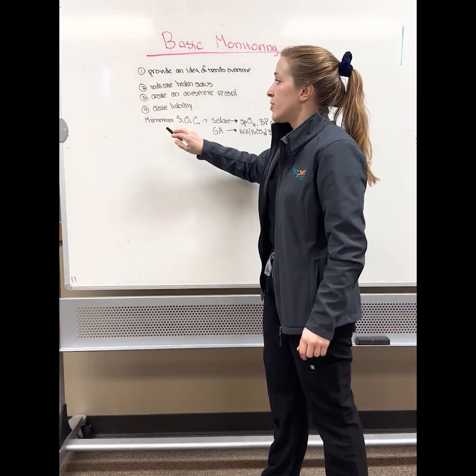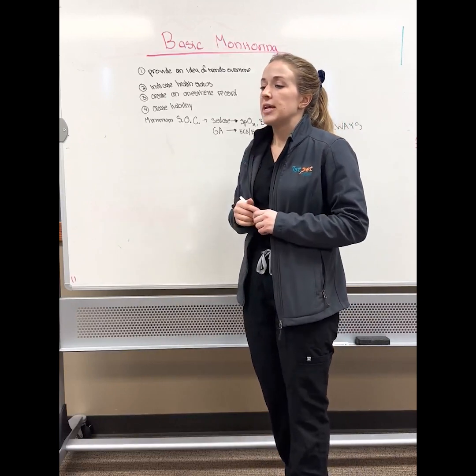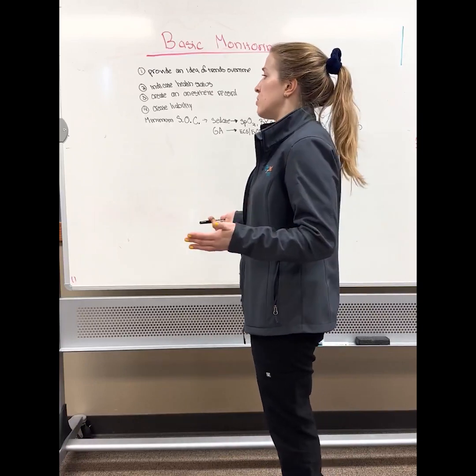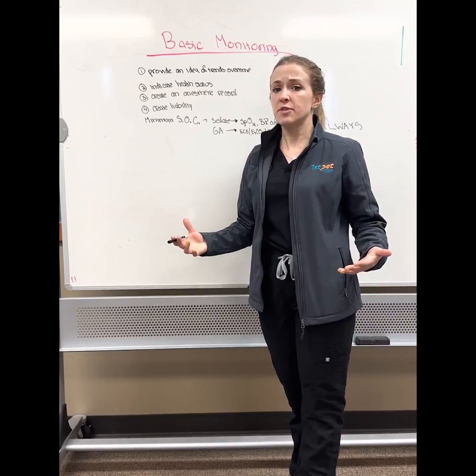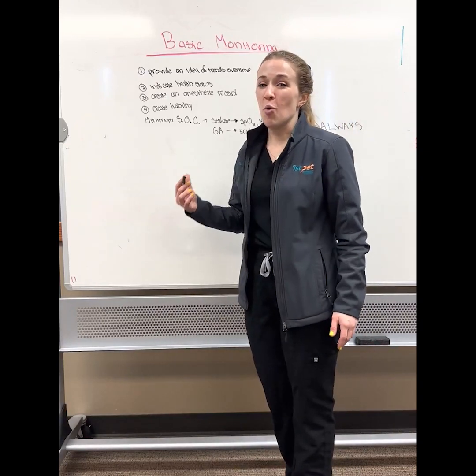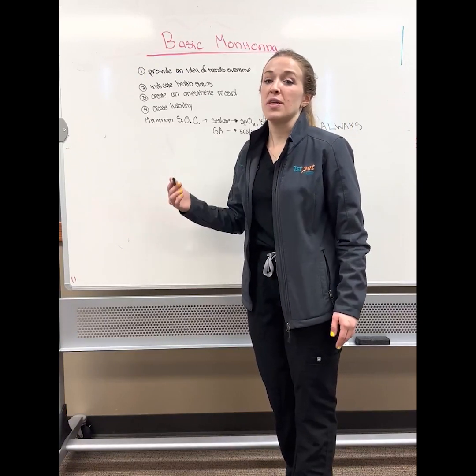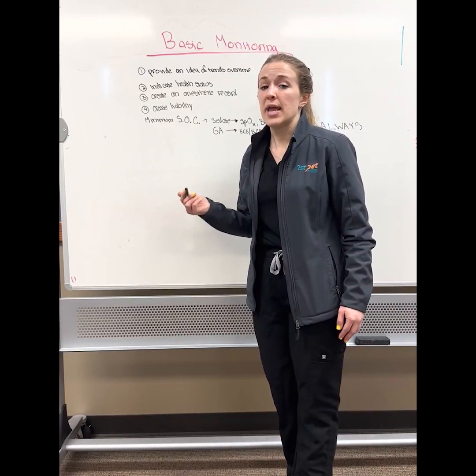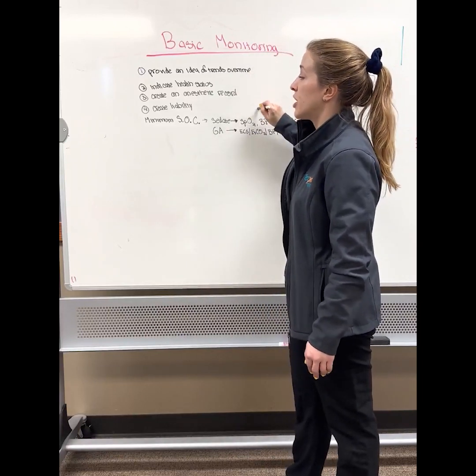This ties in with number 3, but creating liability. The nice thing about having an anesthetic record and monitoring animals is that over time we get trends, we get to see what's happening with our patient, and we have a way to tell what happened and what types of interventions we made if there were any problems. It would never hold up in court to say that you did not monitor an animal or did not have a record when there was a complication that occurred. That would be a really easy way to upset someone and get someone in a lot of trouble. So try to do your best to make sure that you have an accurate, up-to-date record.